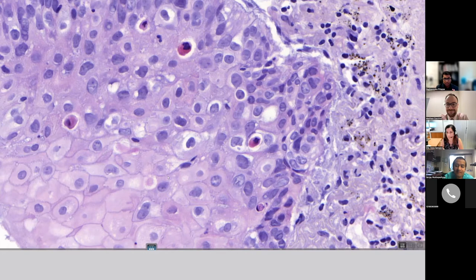My take on that, Raghav, is that when there is significant mucin, enough mucin that you can call something an adenocarcinoma, that mucin is usually clearly visible on H&E. And when there is not significant mucin, when you're really struggling, is that one little blob a mucin blob? Even if you find that it's mucicarmine positive, you're still in doubt whether this is significant or just an entrapped gland or some sort of bronchial epithelium. So, at least in my bias, I don't find doing mucicarmine really helpful. But I do know people who do mucicarmine stain even in the current day and age. I think it's a matter of personal preference.